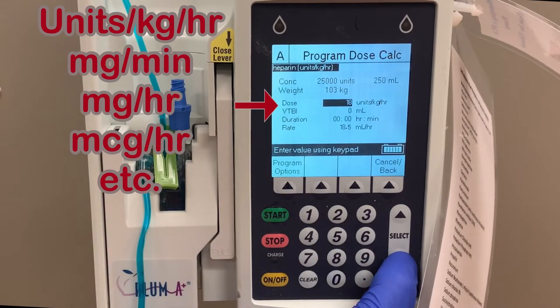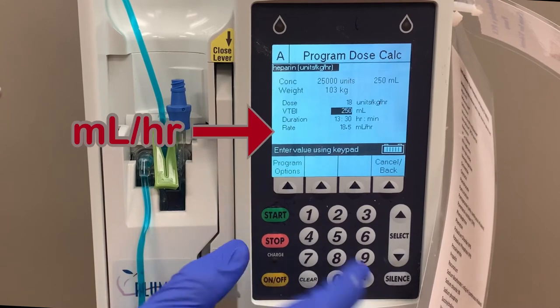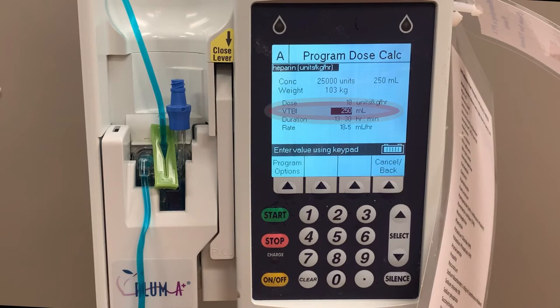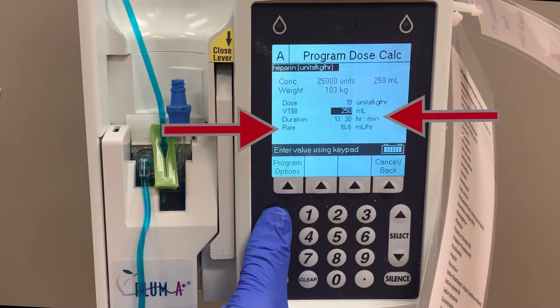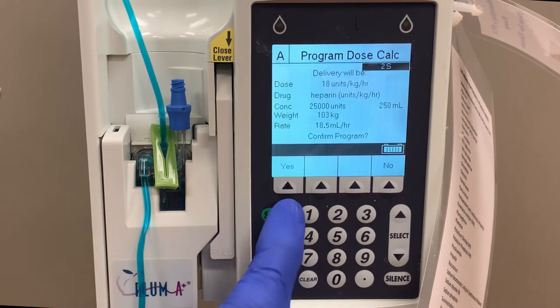Because of the variation in dosing of different medications, it is important that you enter this value in the dose category and not the rate category, which is always measured in milliliters per hour. The next field is VTBI, or volume to be infused. This is the total amount of fluid in the IV bag. With dose and volume entered, duration and rate will auto-calculate and fill in the numbers themselves. With your program complete, press start. Read through the program to verify that everything is correct, and then press yes to confirm.